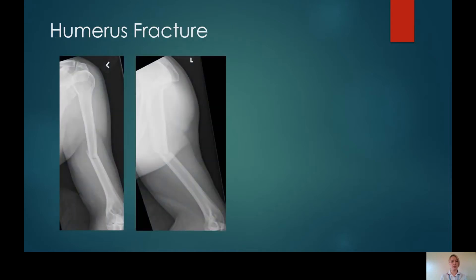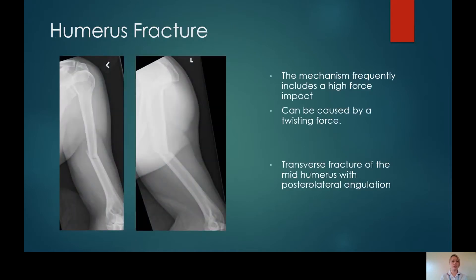We'll start by looking approximately to the elbow joint. Humeral fractures tend to be very obvious — they're difficult to miss — and they're caused by high force injuries. I have also seen them before with a spiral twisting force in the case of arm wrestling. In this case, there is a transverse fracture of the mid humerus with posterolateral angulation.